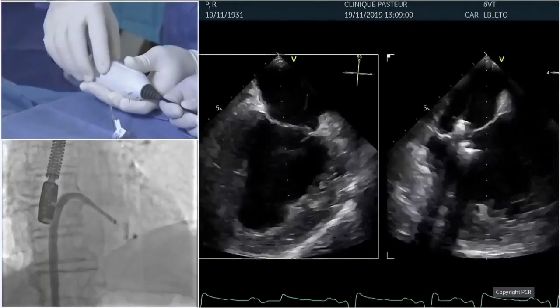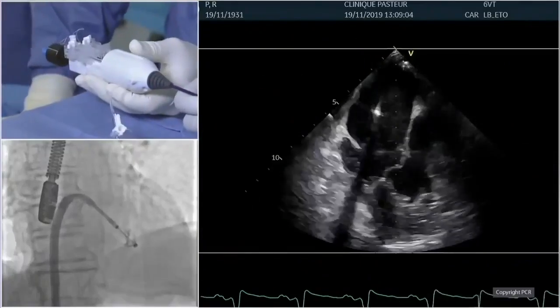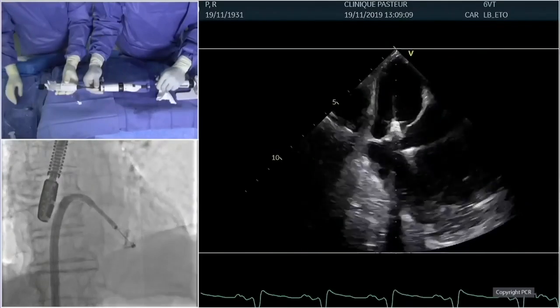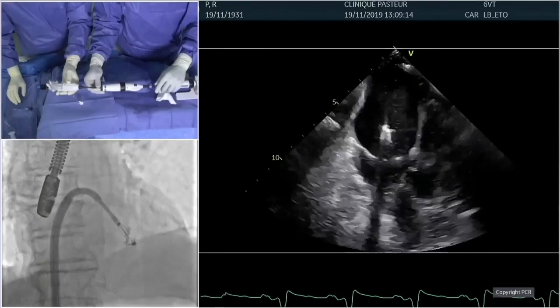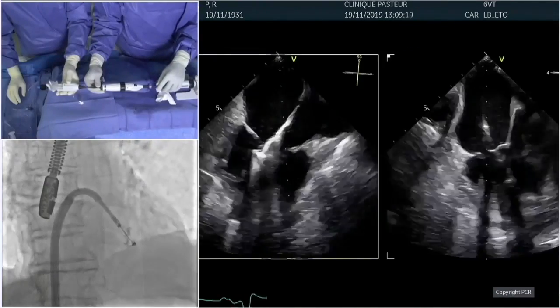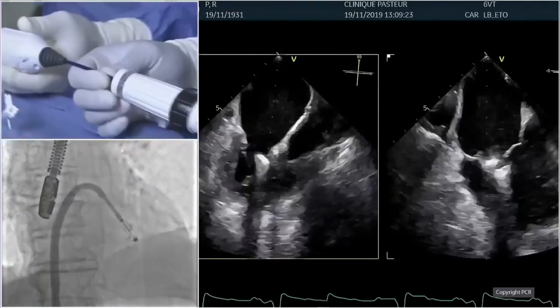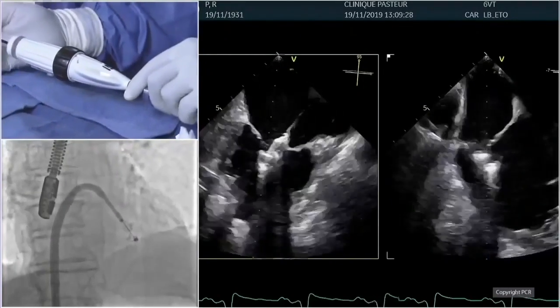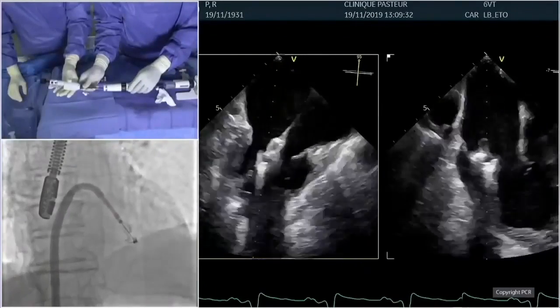Thank you, Nico. And the clasp up. And as the trajectory was quite nice, what I'm going to do is to push a little bit the steerable just to be a little bit more lateral. Could you show us X-plane with the bicommissural, please? There's a fair amount of respirophasic movement, and sometimes we'll do this on a breath hold, but you have to reposition on the breath hold too, because it'll usually bring it medial. So you want to be lateral.